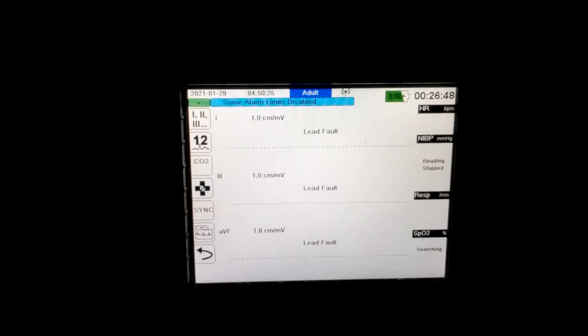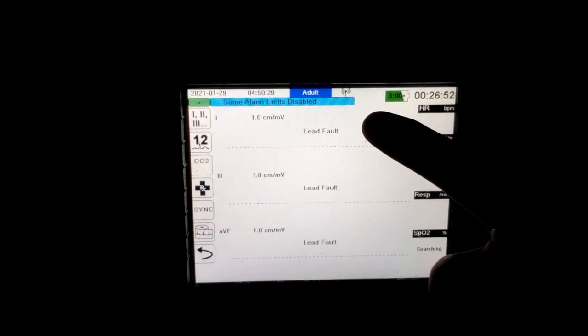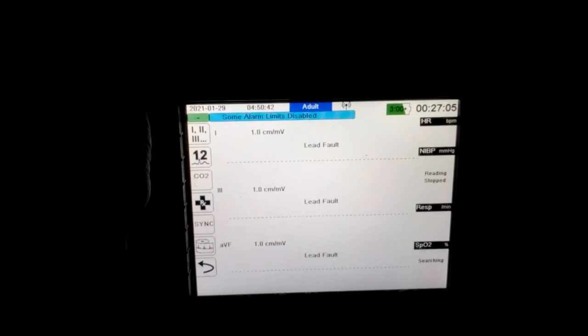A prerequisite for transmitting the vitals is to ensure that we do have a Wi-Fi signal. Again, it's that little antenna at the top with parentheses around it means we have Wi-Fi, with dots around it means we do not. So as long as we have a signal, we can transmit our vitals. Excuse me, not to the hospital, this is for our ImageTrend.